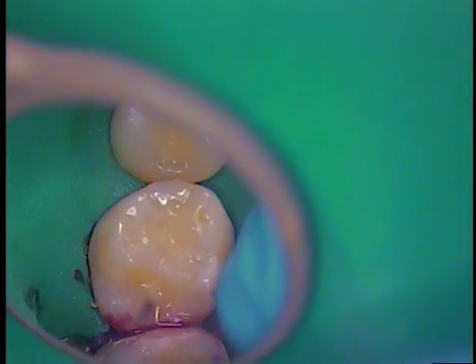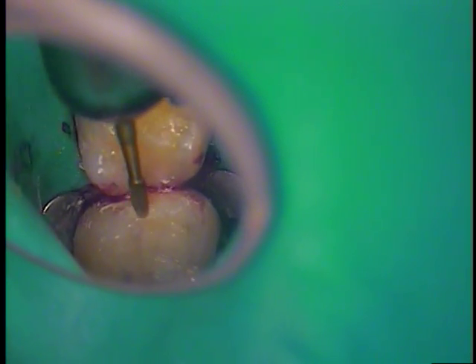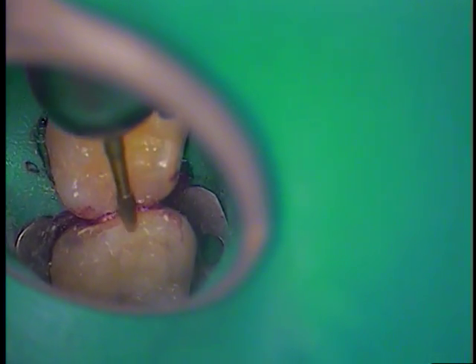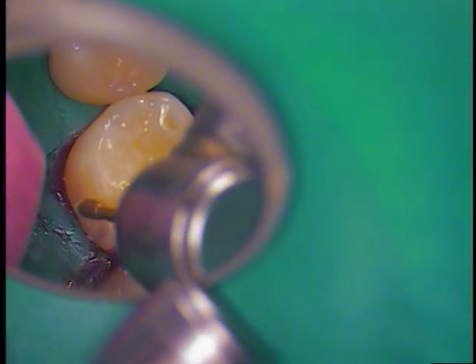We're still hanging in there with our rubber dam, and that's great. I'm going to do a little bit of trimming here before I get critiqued. Some viewers feel that this part of the procedure may cause issues with enamel, but I'm just staying on composite - I'm not touching enamel. I try to avoid it as much as I can. This is all composite.